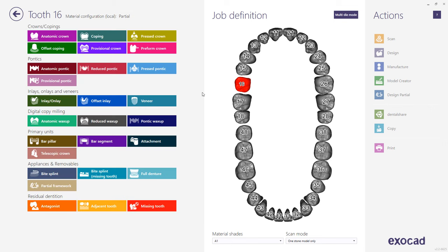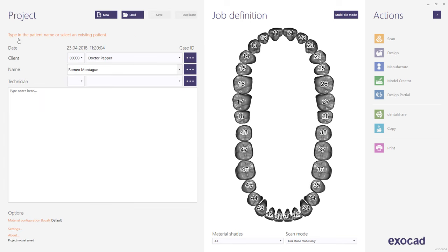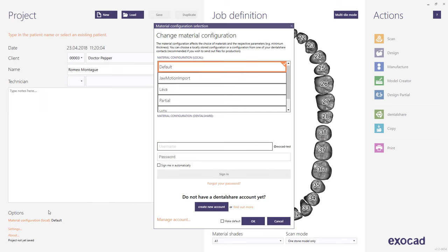Next, choose the teeth that the partial will be replacing. If you do not see the partial framework choice in the job definition, choose a different configuration preset that includes support for the partial framework. Choose the partial setting located below Options in the material configuration. If you are working on a station mainly used for designing partials, this can be set as a default.